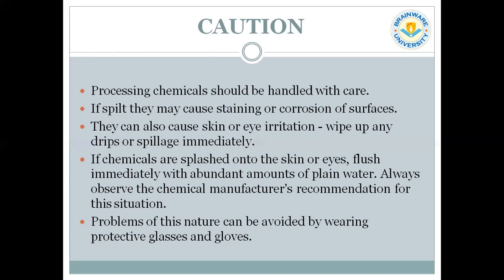So we can maintain the proper use of chemical solutions at the time of automatic film processing.